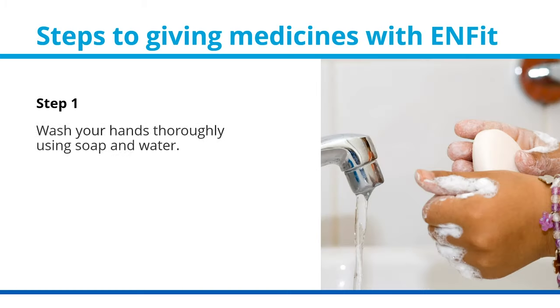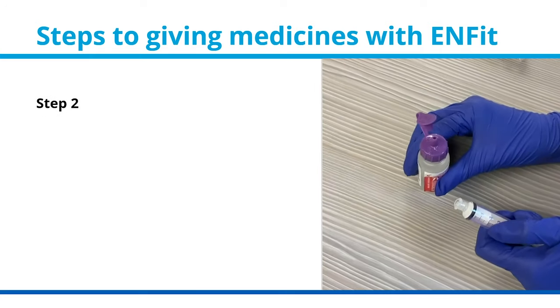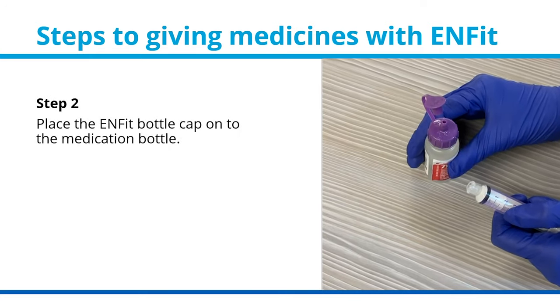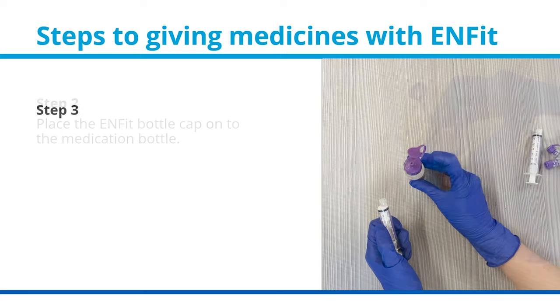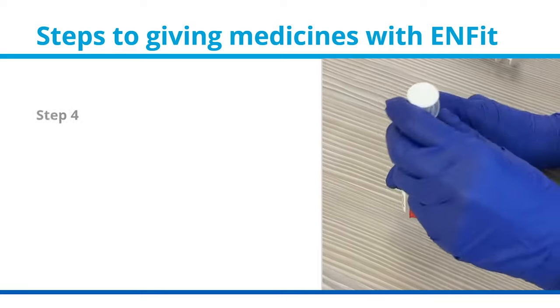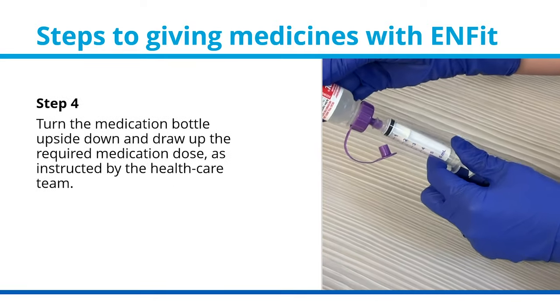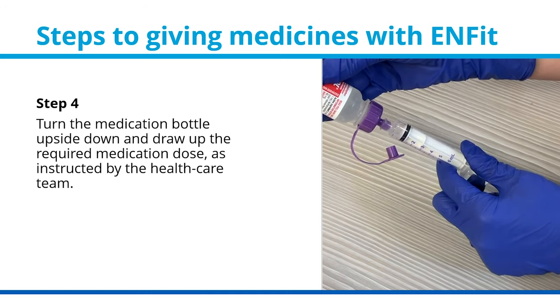Step 1: Wash your hands thoroughly using soap and water. Step 2: Place the ENFIT bottle cap onto the medication bottle. Step 3: Connect the ENFIT syringe to the bottle cap. Step 4: Turn the medication bottle upside down and draw up the required medication dose, as instructed by the health care team.